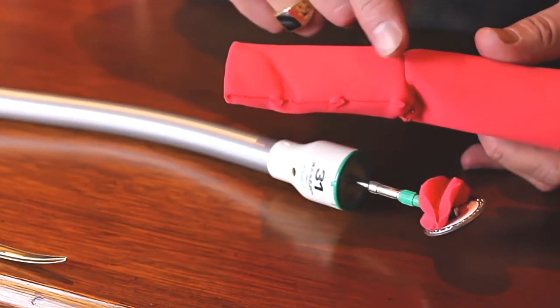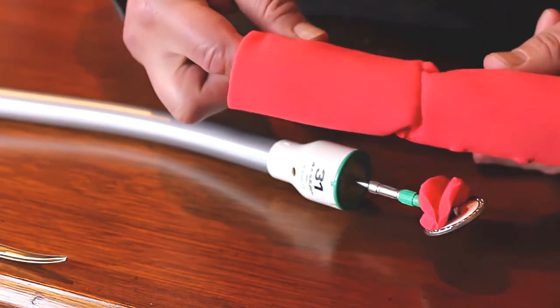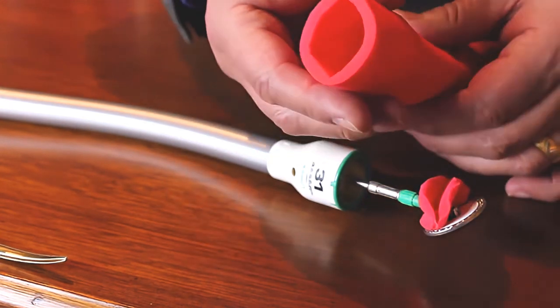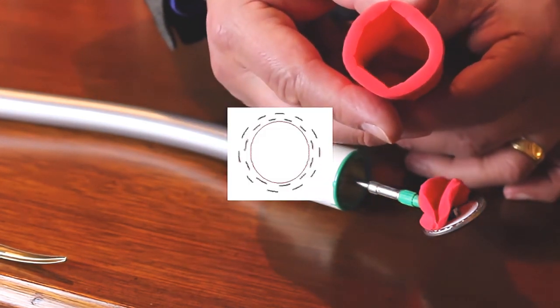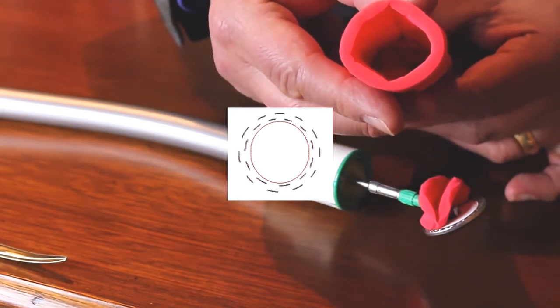So you see now both halves are being joined in a circular manner, and I don't know if you can see this, but if you look down the tube, you can see the anastomosis perfectly formed.